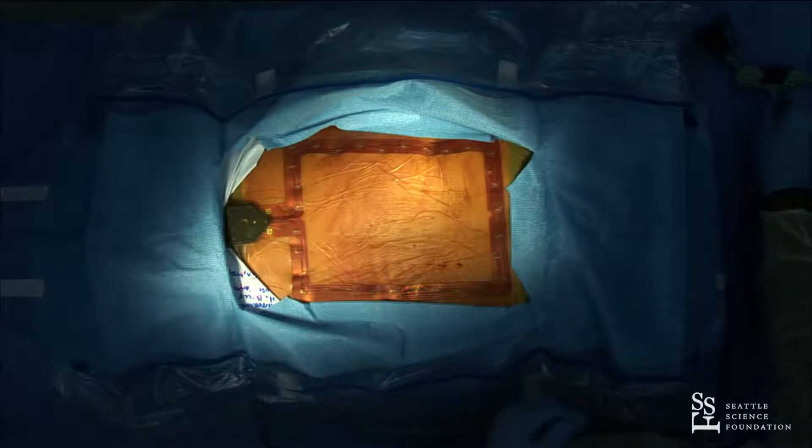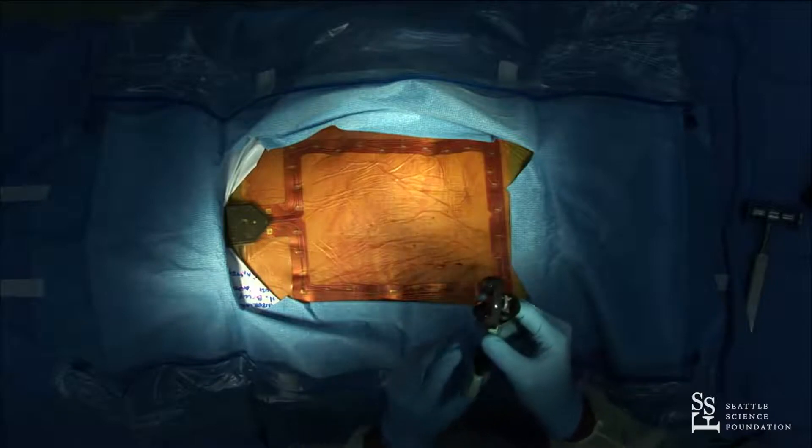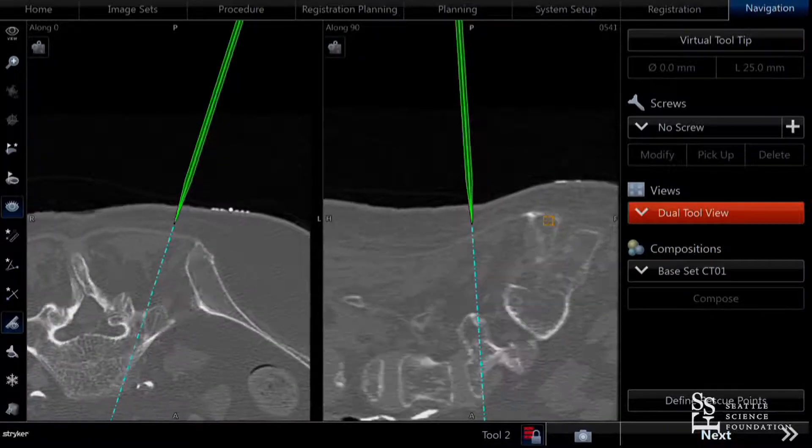I'm going to start by cannulating the pedicles. You can see we have Jamshidis with a tracker on them, and we're going to turn it on so the Jamshidis are now speaking to the Stryker navigation system.